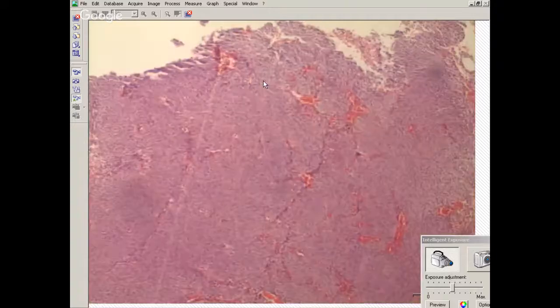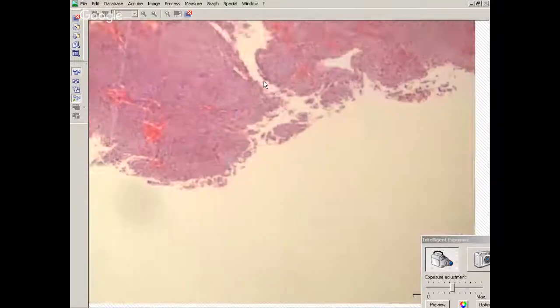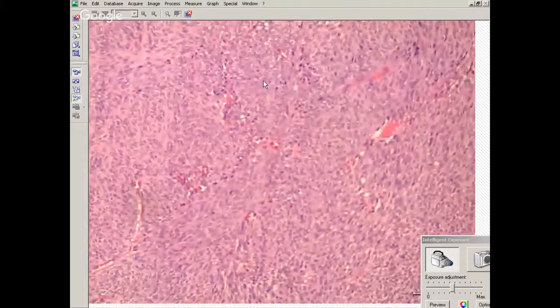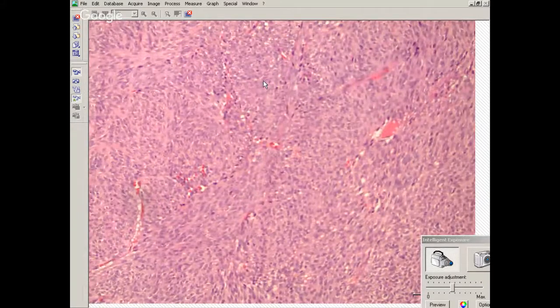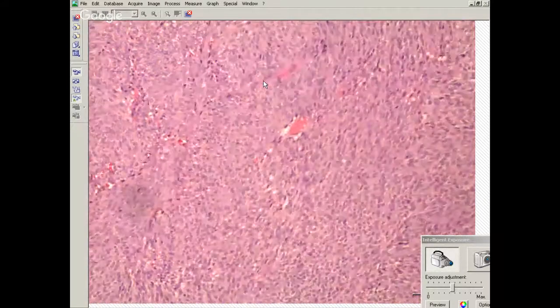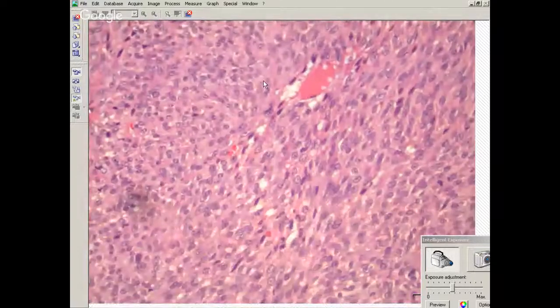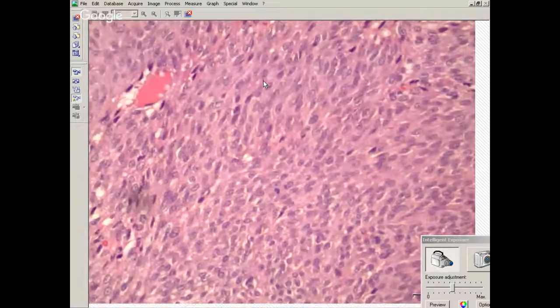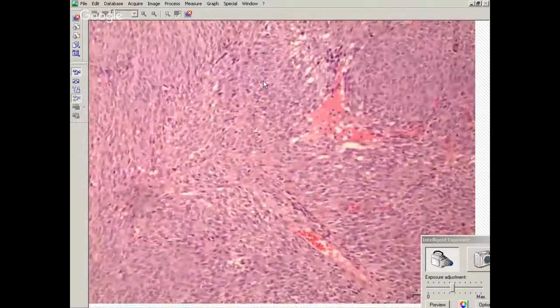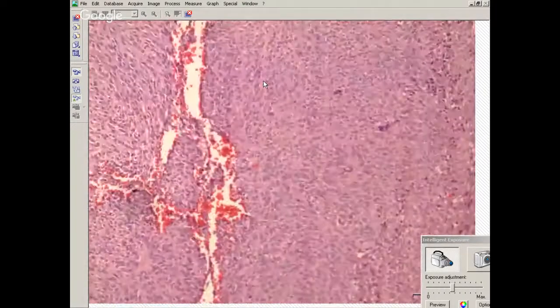This is dural based. It was in the tentorium, and I can tell you right now, when we first got this specimen, and it was first resected, it was called a meningioma, but it's EMA negative. And so on the second resection, I got it when I first got here. I was like, well, this is not quite typical for a meningioma. It's a little funny. It's not forming whorls. It could be a fibrillary meningioma, but it was EMA negative. So I ordered a few additional stains. I got an S100 and it was diffusely positive.